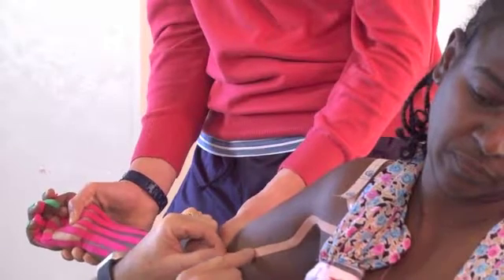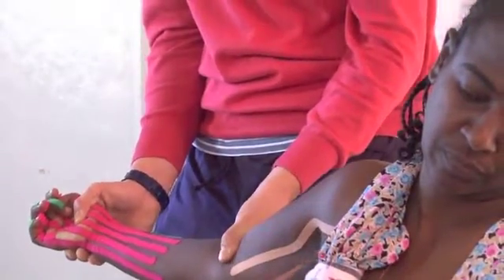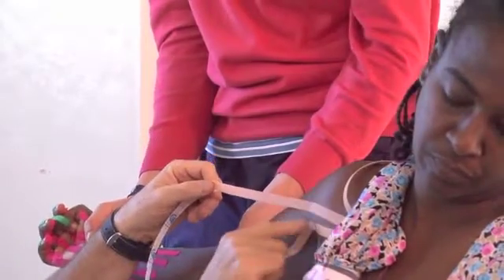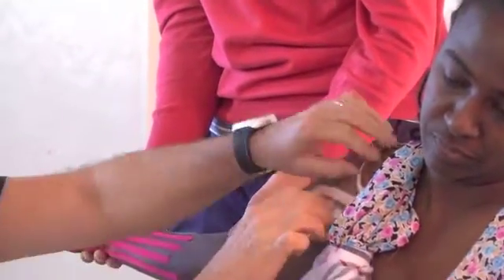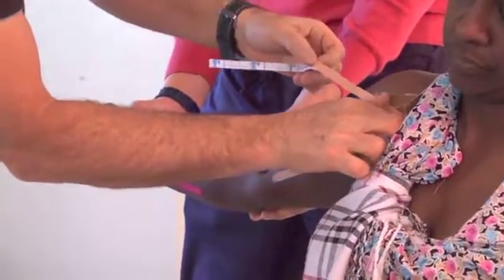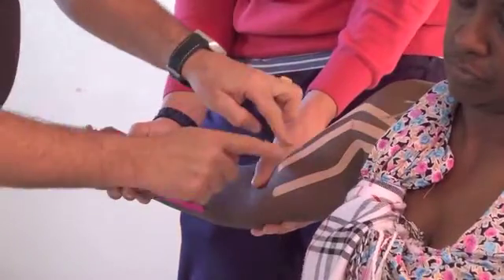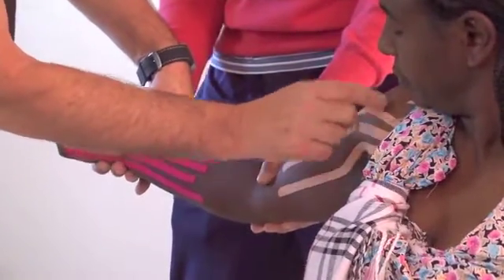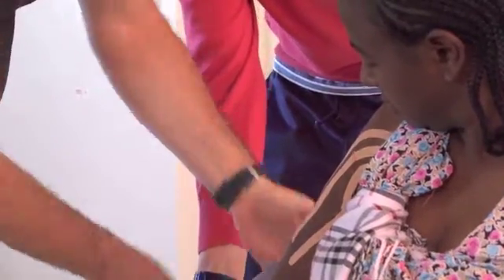Change direction to the medial border of the biceps. Second one: push the skin, go towards the anterior armpit corner, change direction to the middle of the biceps. Next one: still push the skin towards the center, apply the tape, and then lateral border of the biceps. So you see here — the tape all comes down to the same point. In this position the skin is stretched; when we lower it, it is not stretched.